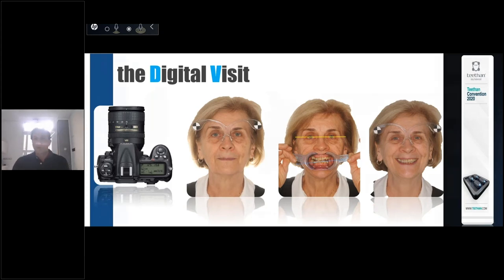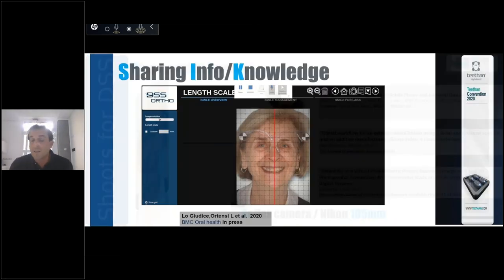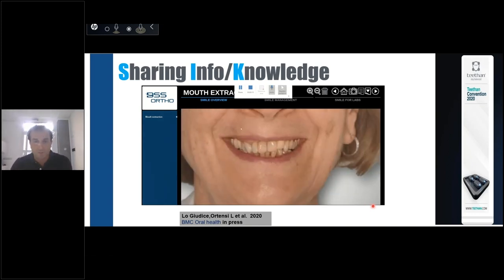I took two pictures of the patient with these special glasses and a reflex camera, and I did a virtual planning. This was my design on the patient in this software. It's not important, but I want to know something more about the setting of the patient, because I'm doing a first visit and I want more information for this patient.